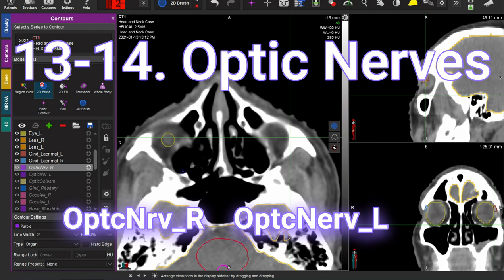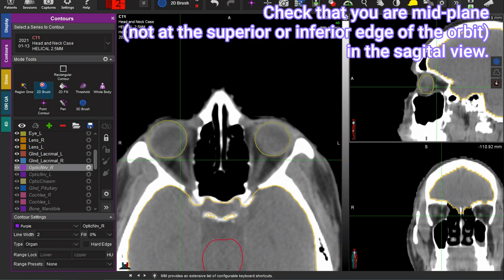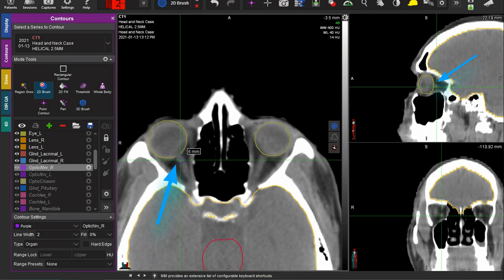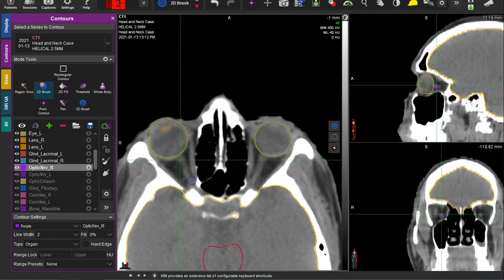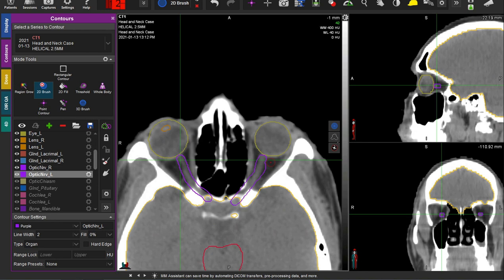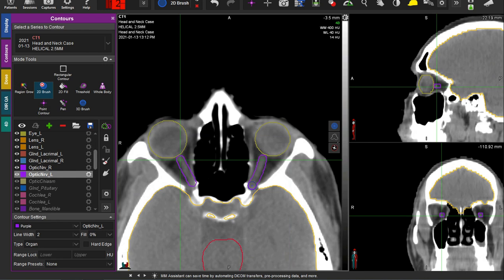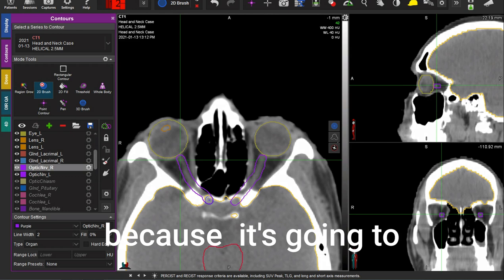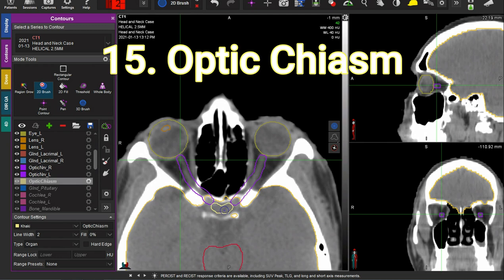Now we're going to do the optic nerves. The challenge here is being able to distinguish rectus muscle from optic nerve. You know it's optic nerve when you click and you can see that you're kind of mid-plane in the sagittal view — sort of confirmed — and you begin to trace what you see. Scrolling up, the optic nerve will pass through the optic canal in order to enter the brain. Here it's passing through the optic canal, and here is where it began. I like to draw this to the point where it's entering the brain because it's going to connect to the optic chiasm.